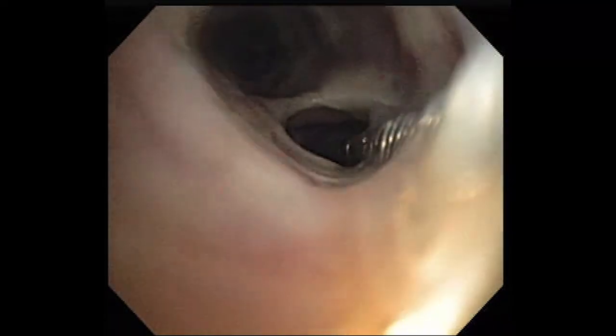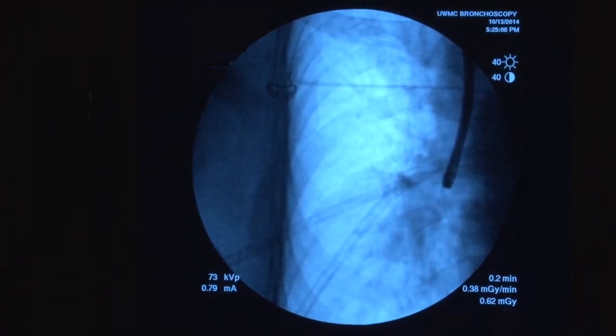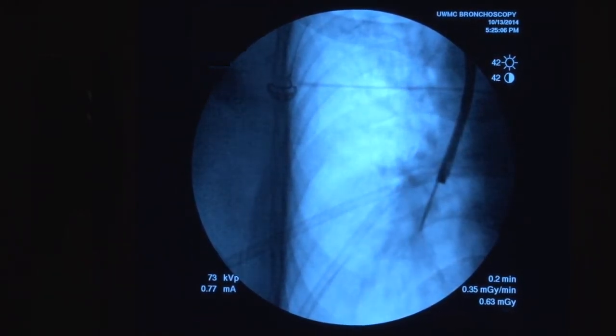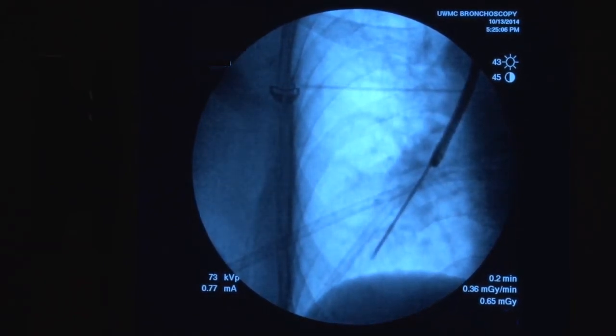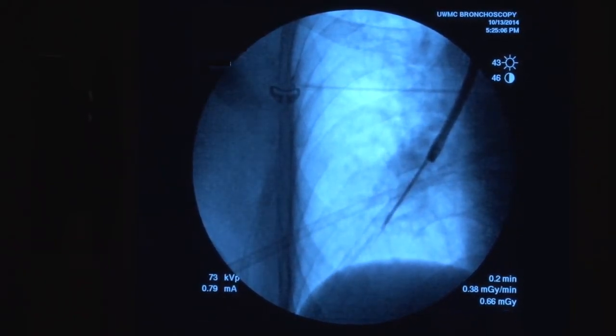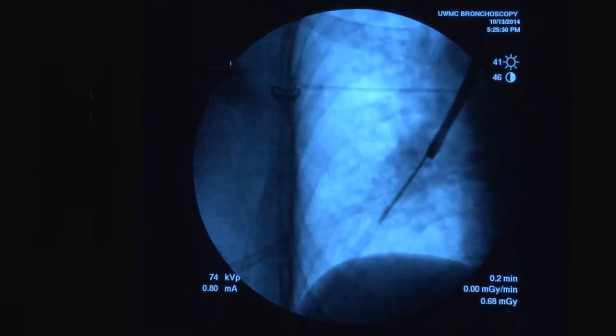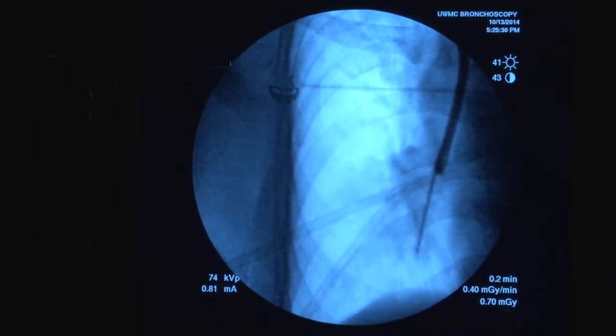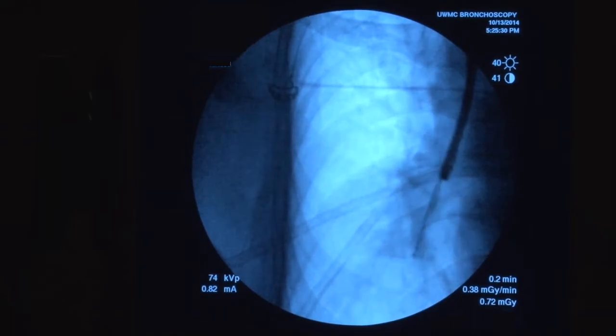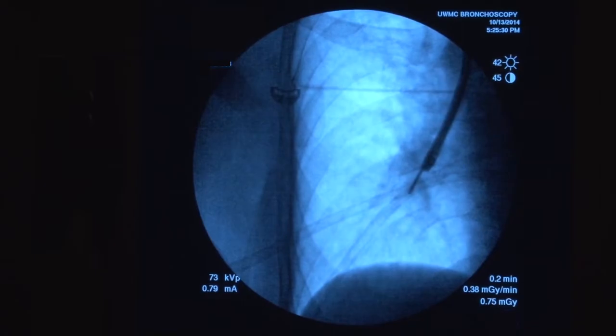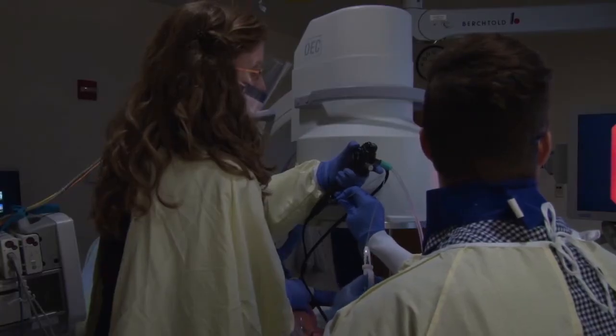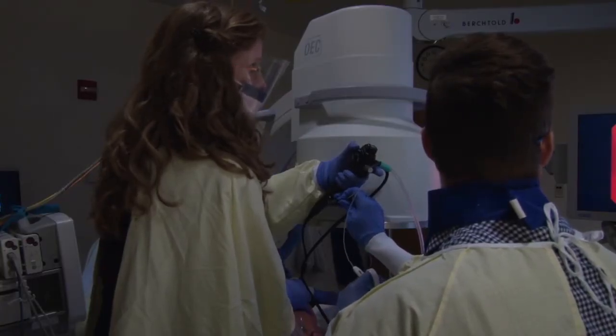Then turn on fluoro when you can no longer directly see the tip of the forceps. On the fluoroscope monitor, watch the forceps advance until you feel resistance or until the tip of the forceps are within a couple centimeters of the chest wall or appear to be within the mass. Then retract the forceps a centimeter or two. Open the forceps and advance until you meet resistance again. Then close the forceps. Once the forceps are closed, turn off fluoro, hold the forceps closed for a second, and then retract.